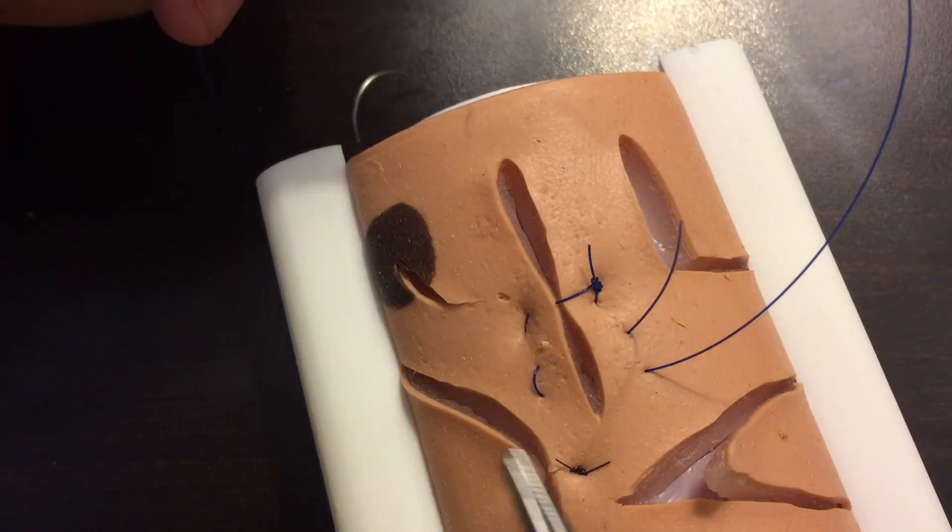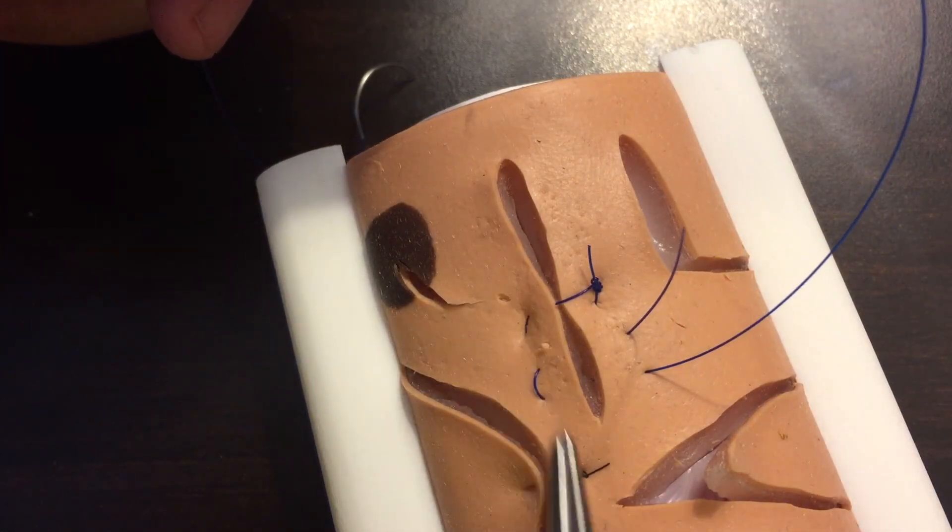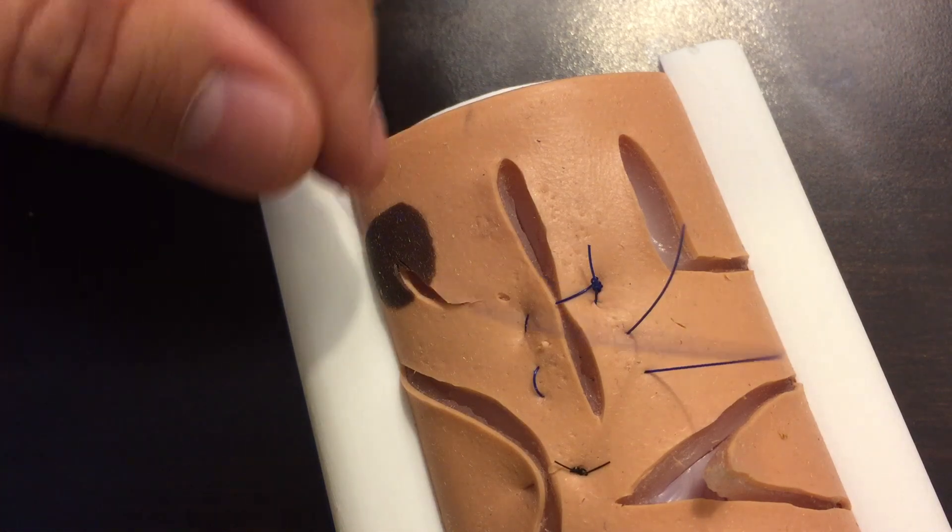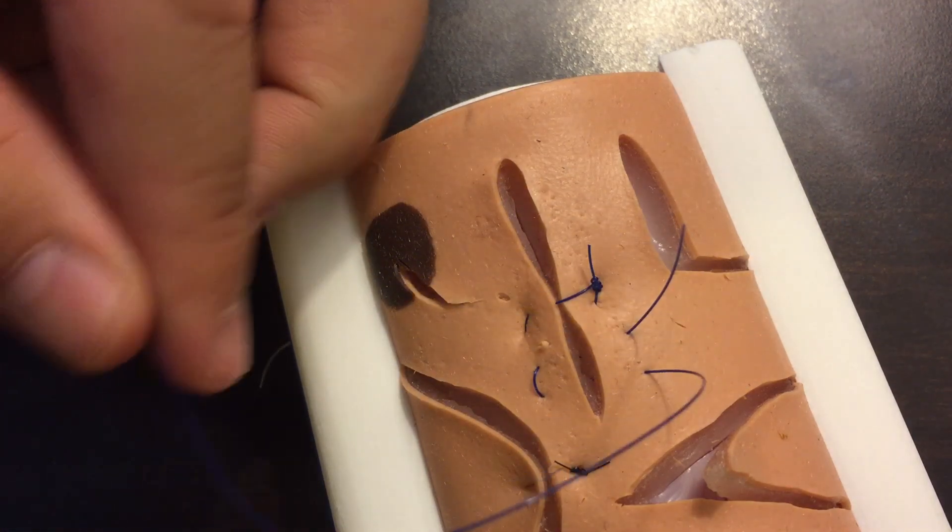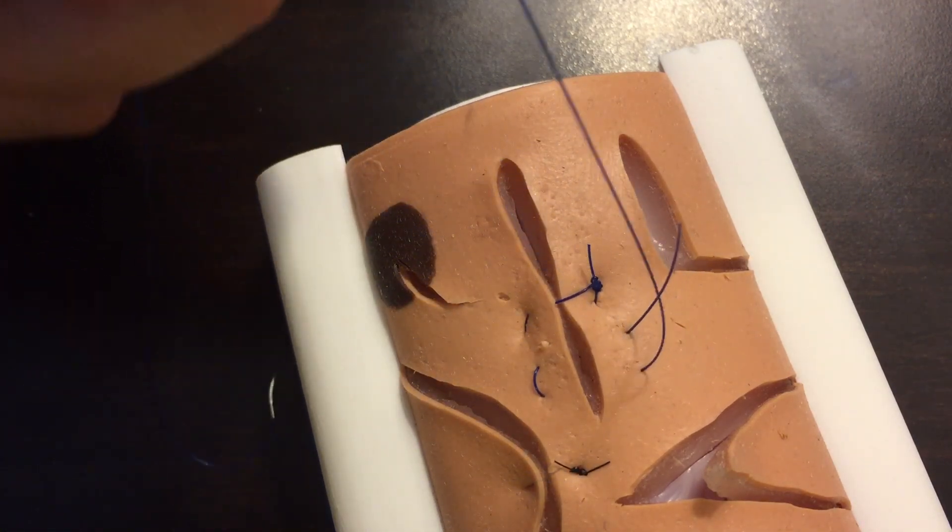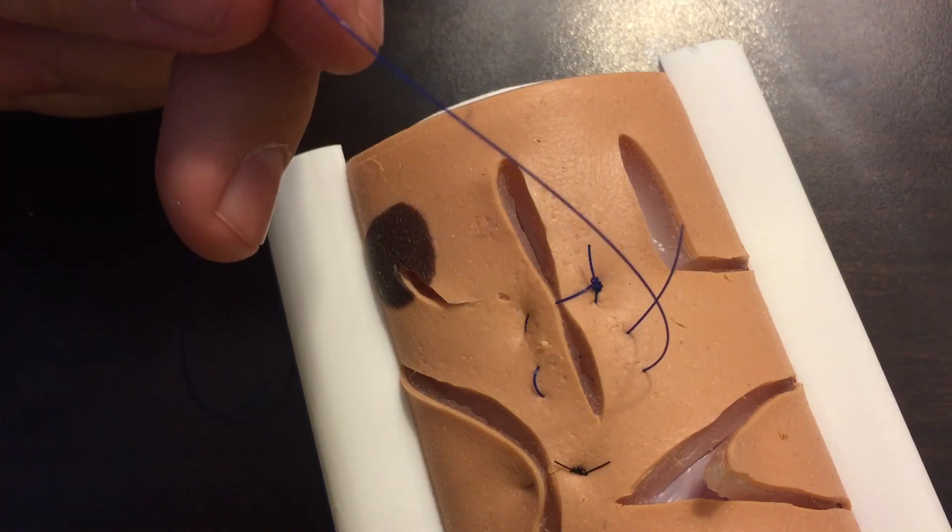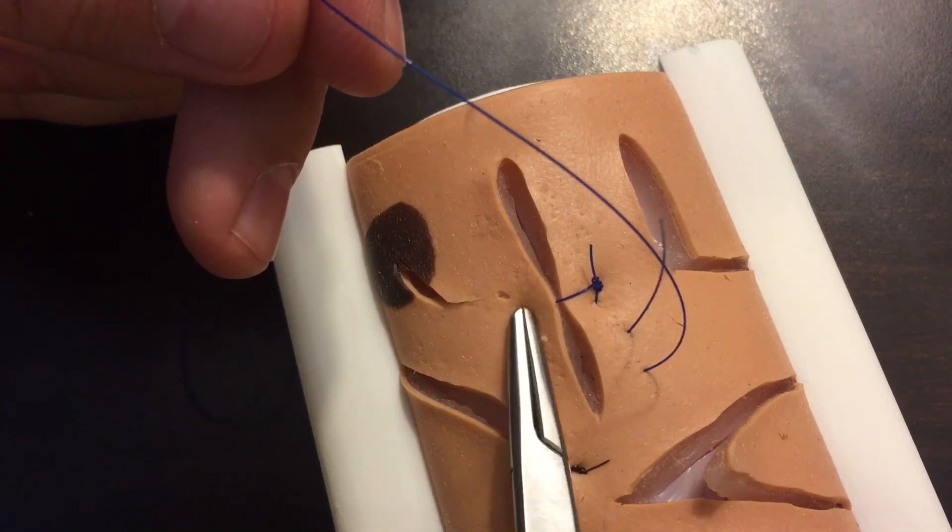This horizontal mattress like this does distribute a lot of the tension along the laceration or along the incision. But again, my concern with this and the reason that I don't use it a lot is because oftentimes it does create little bunches of strangulation or tension.